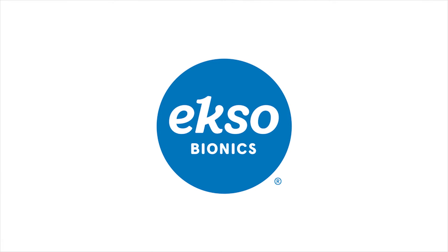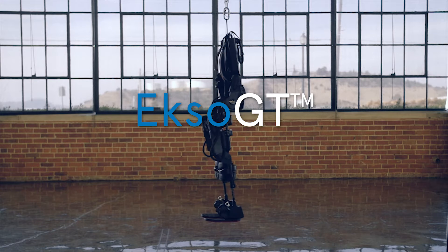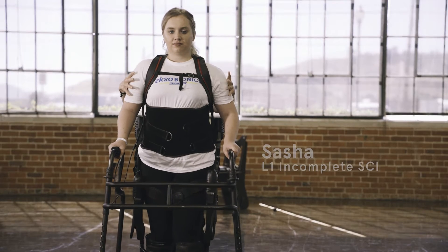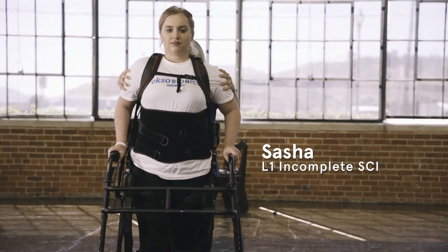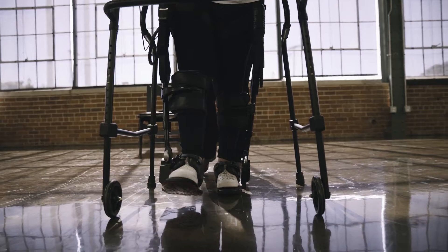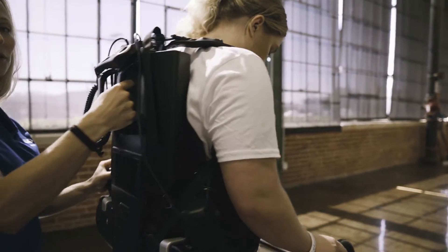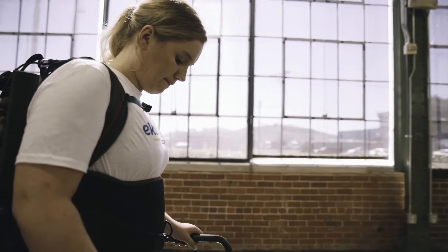Amplifying you. EXO-GT is a wearable robotic gait training device. EXO-GT can be used to address differing goals for ambulation. It can be used to provide the ability to walk for someone who has lost the ability, or EXO can be used as a tool to address physical therapy gait retraining goals.